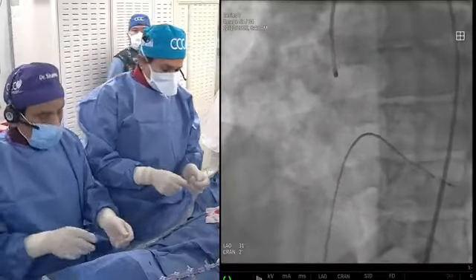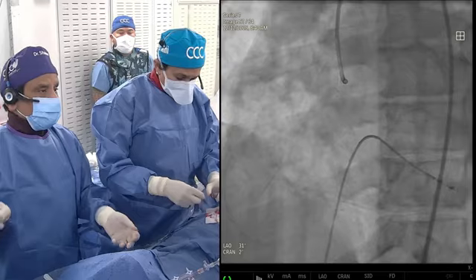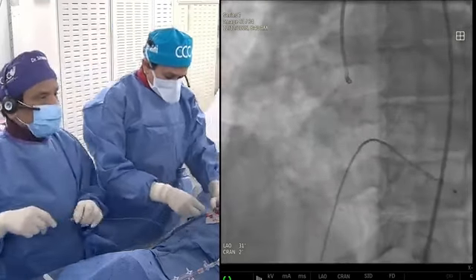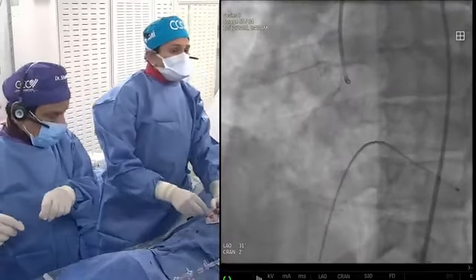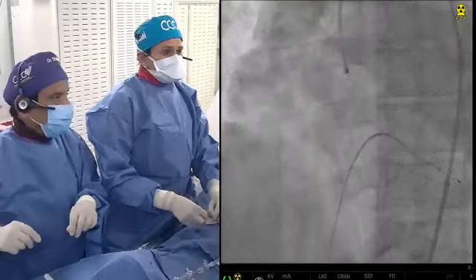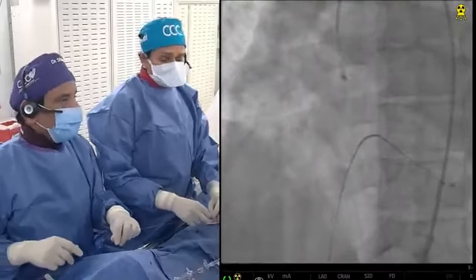Once you go, we can move it now. Or otherwise, AR will work here. AR2 will be a little down pointing. I think AL will be too big. No, no, AR. I think just regular FR may be okay. Let me see if this also does not go, then we change to it. Okay, good.